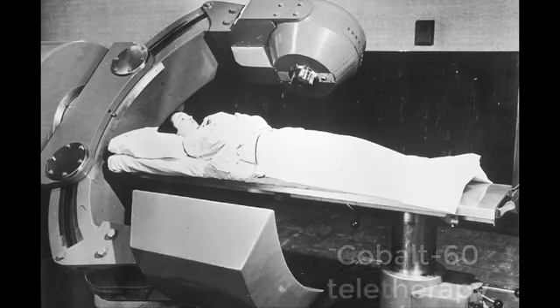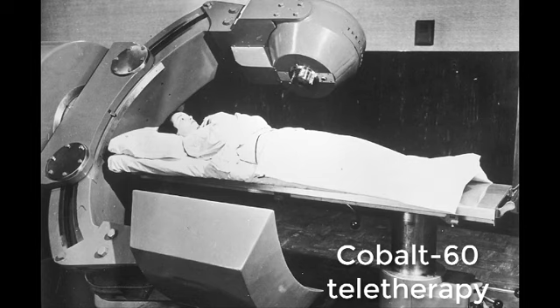So here is a cobalt-60 teletherapy unit. You've learned about cobalt-60 in the previous videos, so you can appreciate how this works. It's got a very high strength cobalt-60 source in the head that opens for treatment. This was really an outgrowth of World War II when nuclear reactors were developed, and it was discovered that you could activate cobalt-60 to very high specific activities that could be used for therapy.